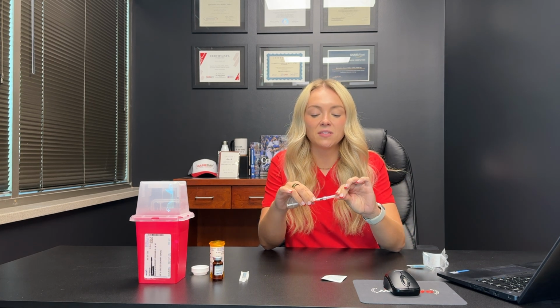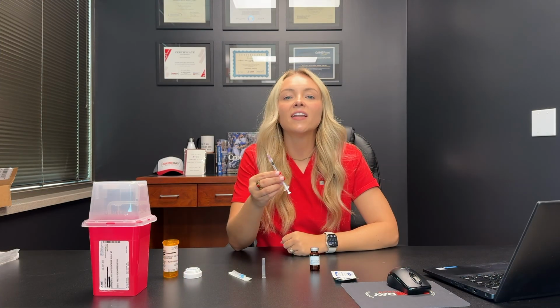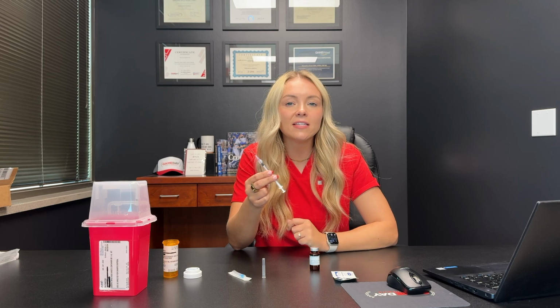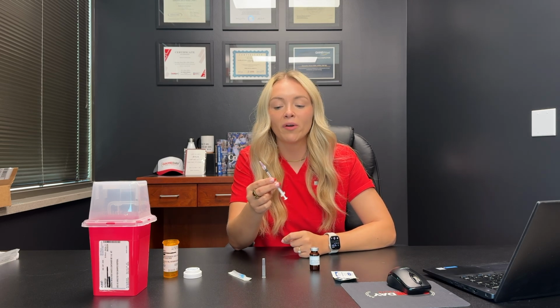I open the package with the pink needle. And these are Luer lock syringes. So I just need to take the needle and the syringe and twist them together. Next, we're going to draw air into the syringe by pulling the plunger to the exact dose that we're prescribed. This patient's dose is 80 milligrams, which is 0.4 mLs.